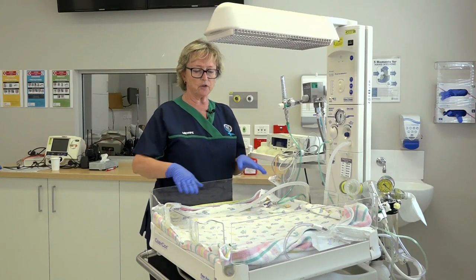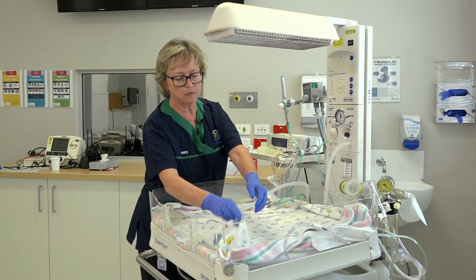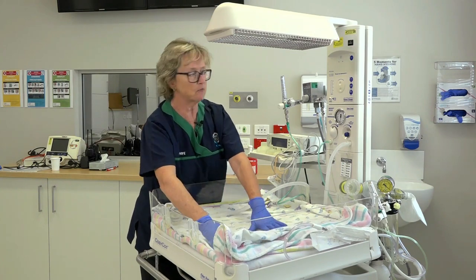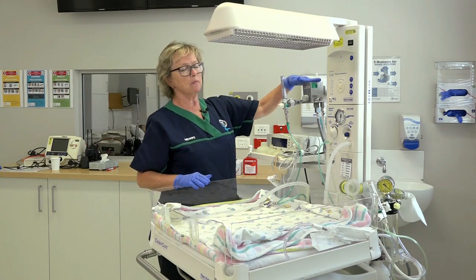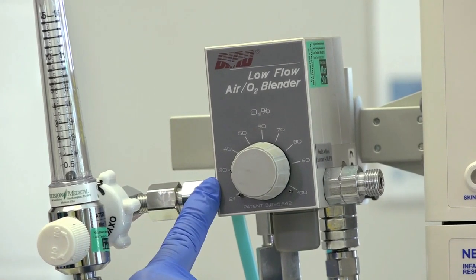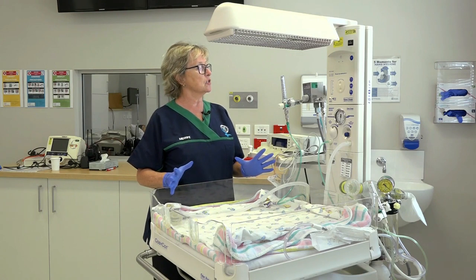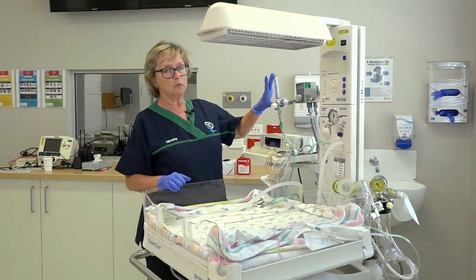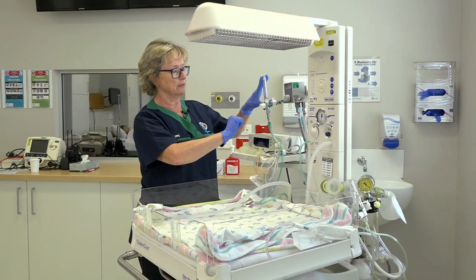By this stage, you've got a nice, firm, flat surface with warmed towels and wraps. We've got something to use to dry the baby, and then something left here to actually wrap the baby in. Ensure that your blender, which is a combination of the air and oxygen, is preset to 30% gas mix as per the WA addendum. This flow meter here will be utilised to control the rest of the Neopuff.